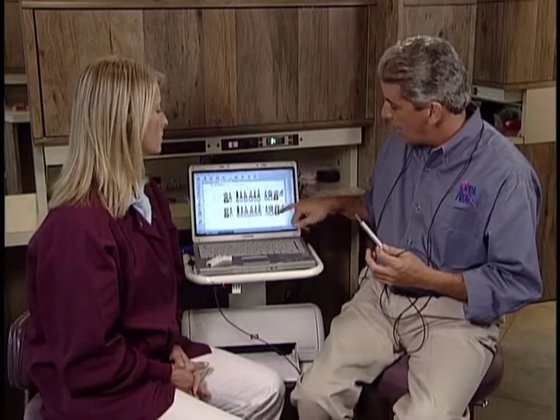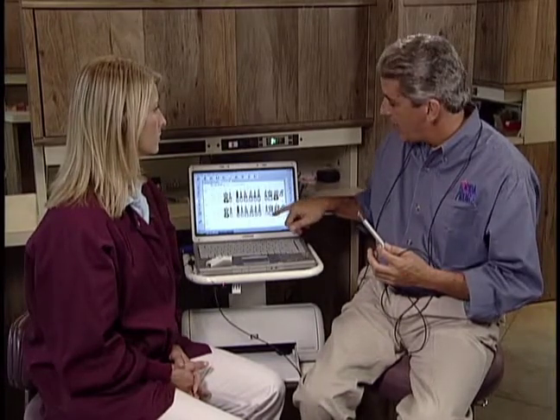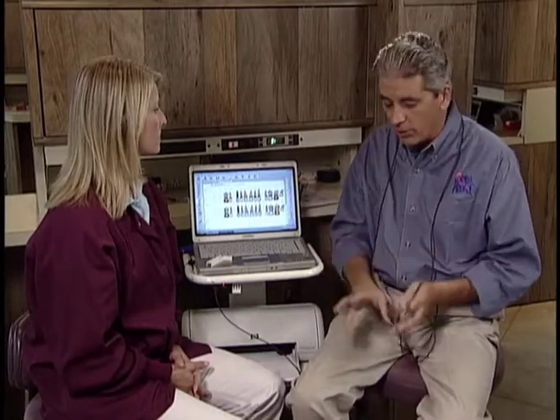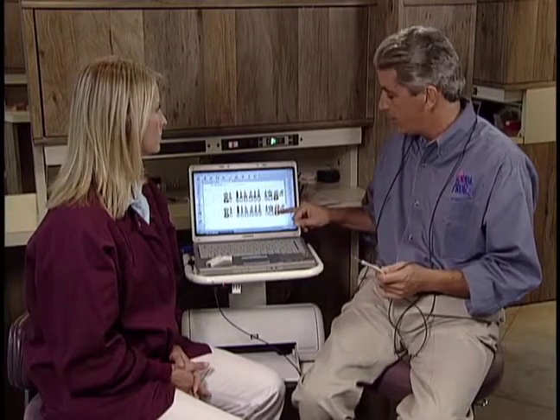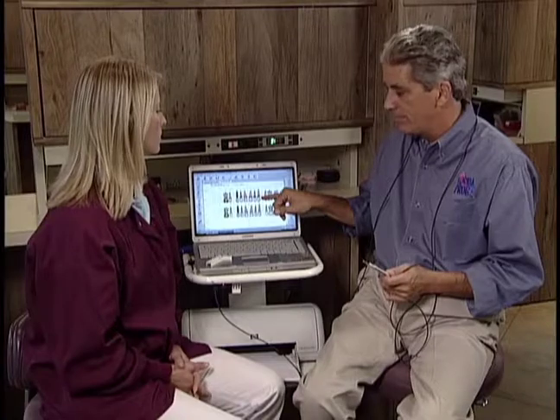I'm on and have probed the straight lingual of 15, and I had delayed bleeding on the mesial buccal of 13. I want to record that bleeding. I want to maintain asepsis and work solo. I can move there with the foot pedal. I could use my undo button, but I'd have to redo all that work, which is not what I'm after. What I'm really after is to move that cursor to the mesial buccal of 13.